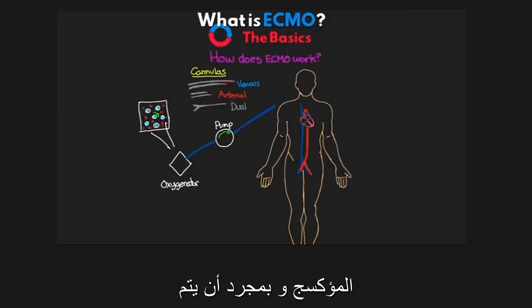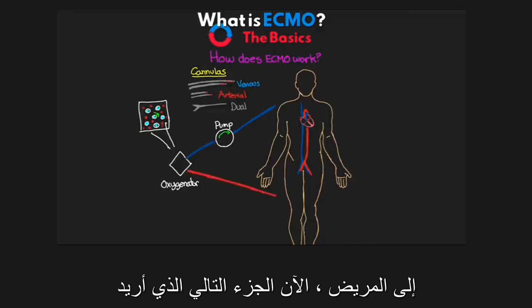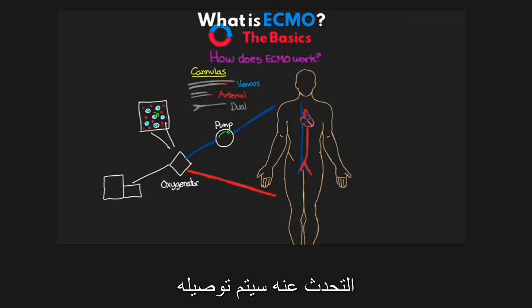Then once the blood is oxygenated in that oxygenator, it is going to make its way back to the patient. Now, the next part I want to talk about is going to be attached to the oxygenator, and really what gives it the gas that it needs for this diffusion.